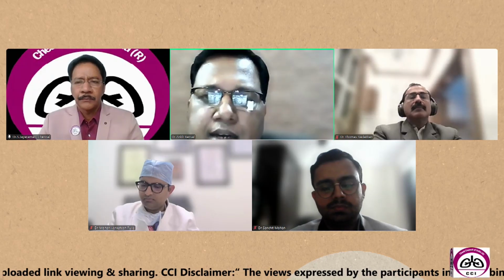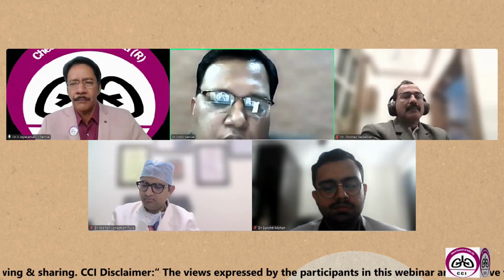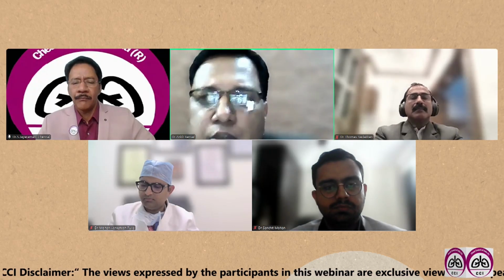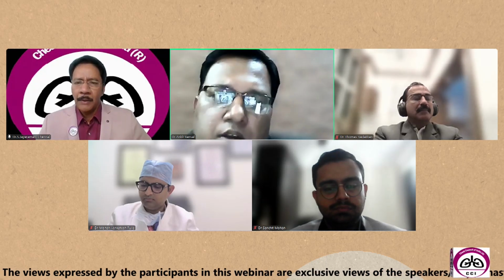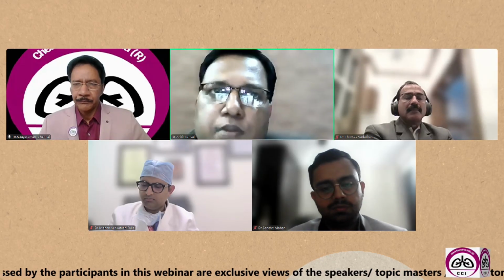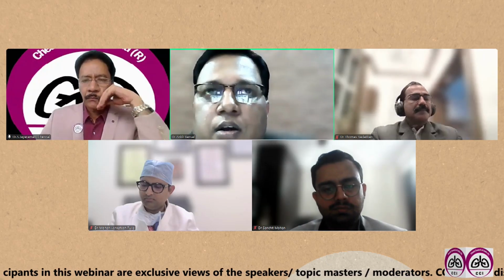Like the pulmonary artery may appear like a hypoechoic shadow resembling a lymph node. Flattened vessels may again mimic a lymph node. Sometimes small veins may not be visible on B mode. So in that case, I think color Doppler should be mandatory before sampling each lymph node.